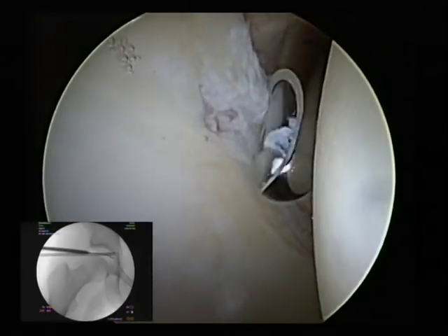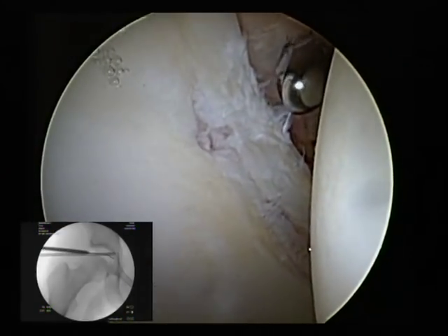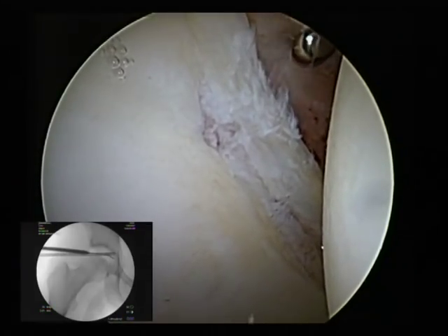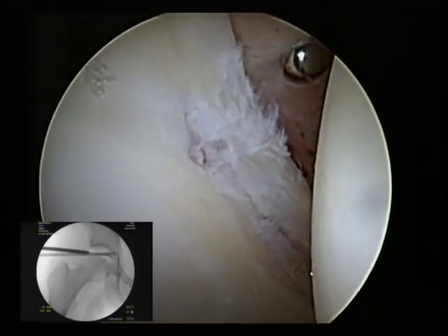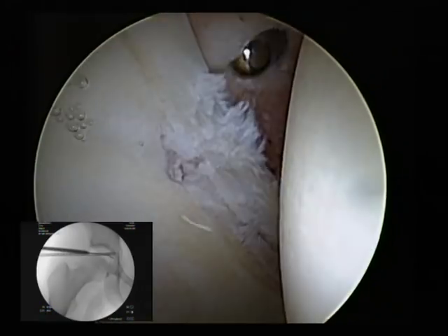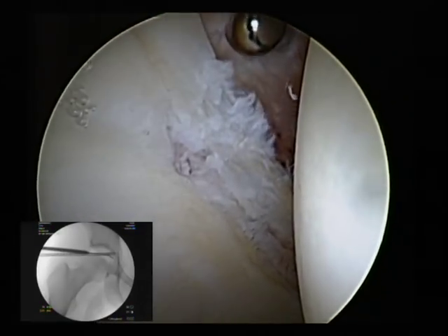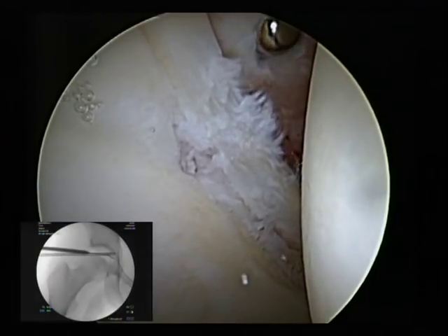We're looking through the anterolateral portal, and my shaver is in the anterior portal. What I'm going to do here is open up the capsule a little bit — do a little bit of a capsulectomy. This is a very safe interval to open up the capsule a little bit to allow more manipulation and translation around the joint.